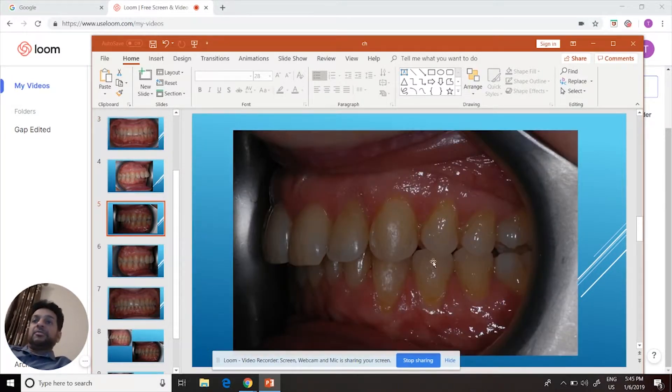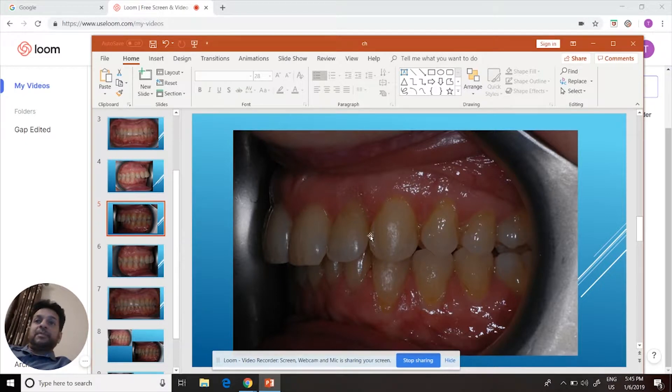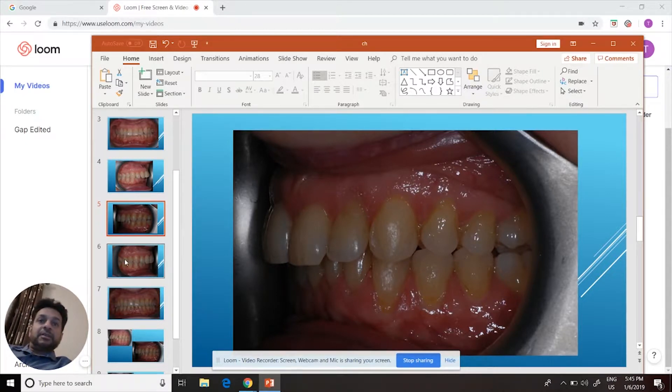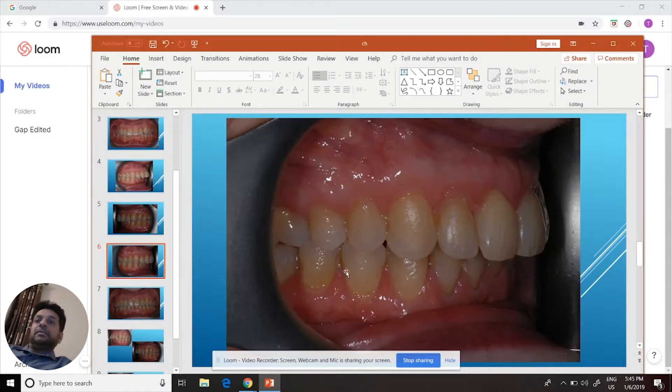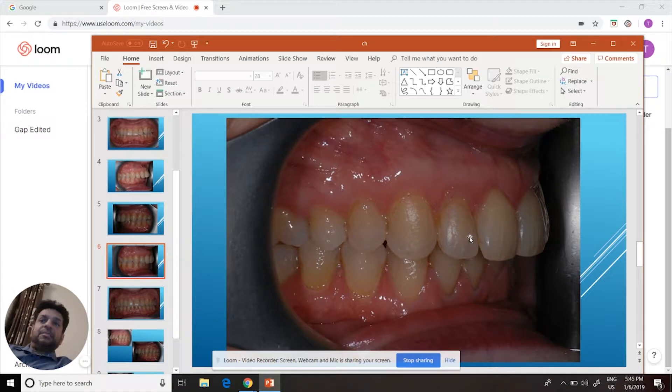This is the final result. Gap is closed, teeth don't stick out. Here's the right side, teeth have been brought back in.